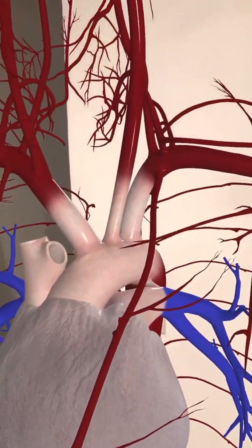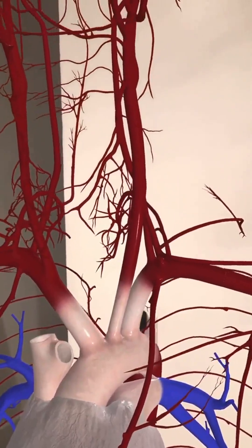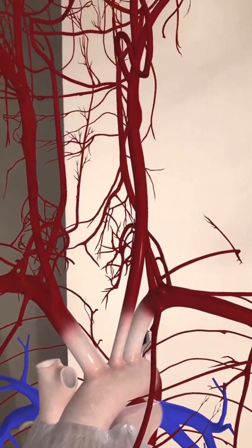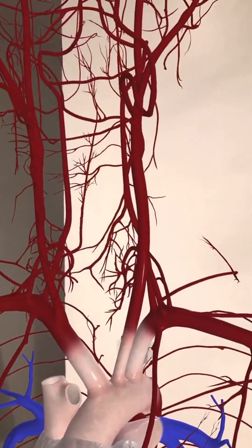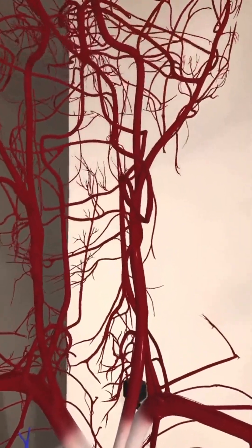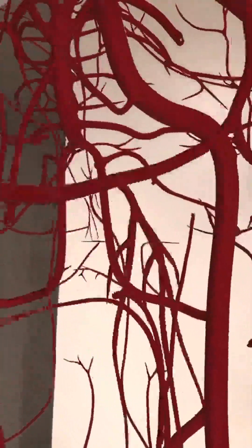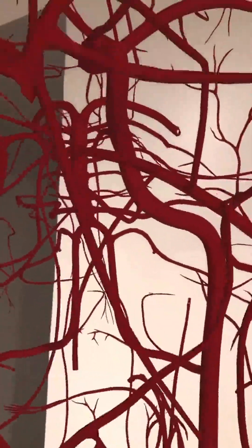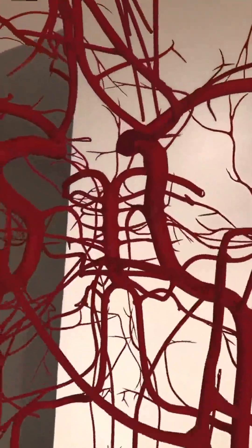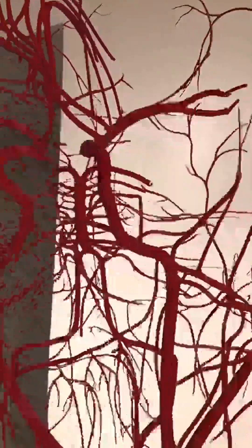We get into the aortic arch, which you see right there — it is an arch. To get onto the left side of the brain, the carotid comes off directly and basically you're in the common carotid. Then you see it split into the internal carotid and we're into the left side of the brain.